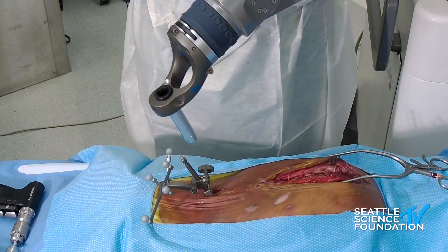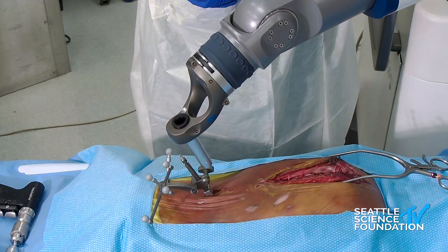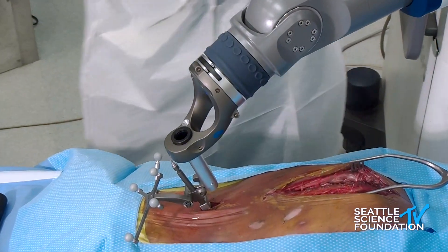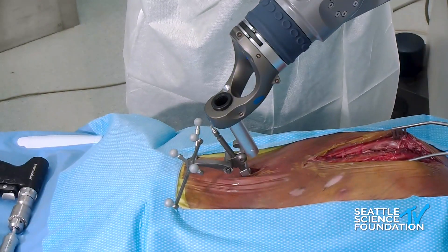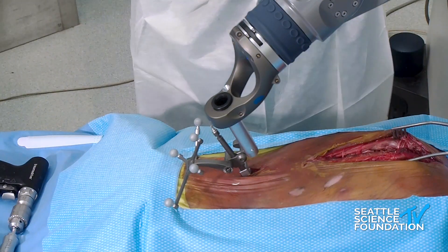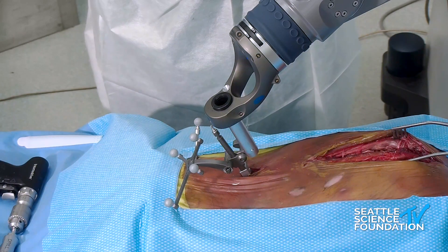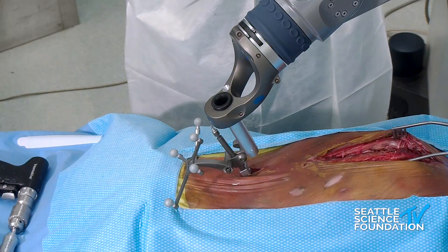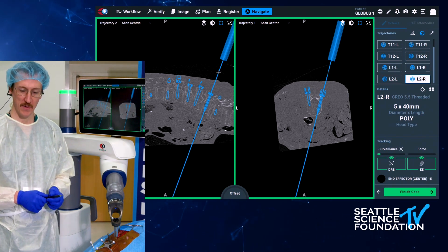While the arm is moving — I noticed that you're using hand drivers. Do you put the screws in by hand, or do you use power? I use the hand driver. I've experimented with power, and I think it's very convenient and it can be very helpful for a lot of people. I actually like the tactile feel, so I feel a little more secure when I can feel the tap going down and engaging the cortices, and then with the screw I can test the bite. For me personally — but I have partners that use the power, and I think it's pretty neat. I can see maybe a little later in my career when the carpal tunnel sets in, that that might be the right way to go.